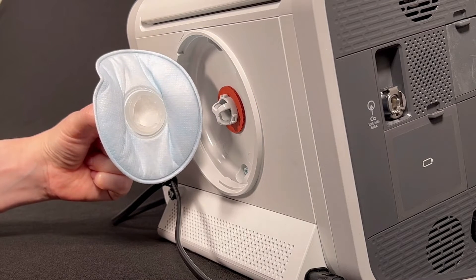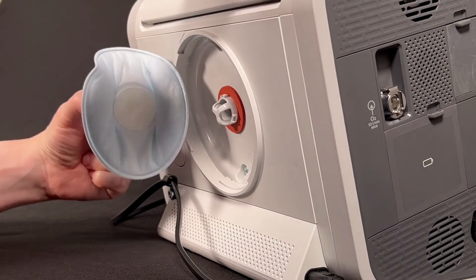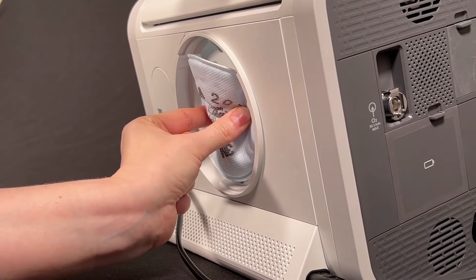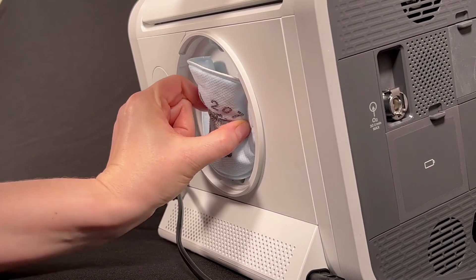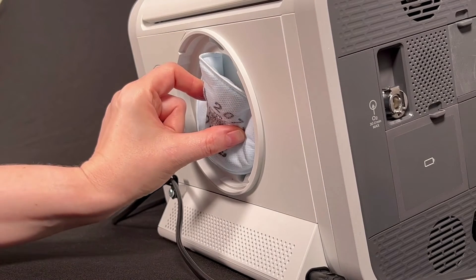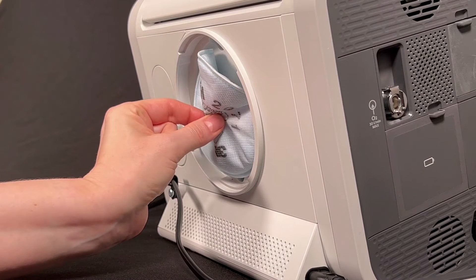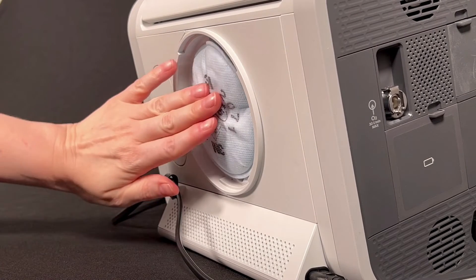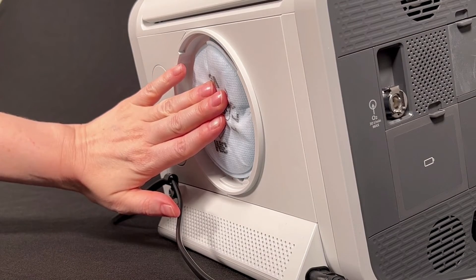Use one hand to keep the Trilogy Evo still. With your other hand, push the particulate filter onto the filter mount to connect it. Twist the base of the filter a quarter turn to the right to lock it in place. To make sure it is firmly connected, pinch the middle of the filter and gently pull on it. Push the filter back and make sure it is flat.